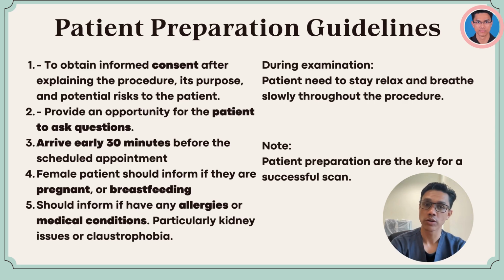Next, we are talking about patient preparation guidelines. Number one, obtain informed consent after explaining the procedure, its purpose, and the potential risks to the patient. This also provides an opportunity for the patient to ask any questions.